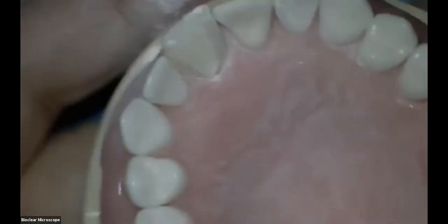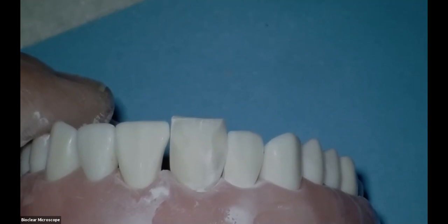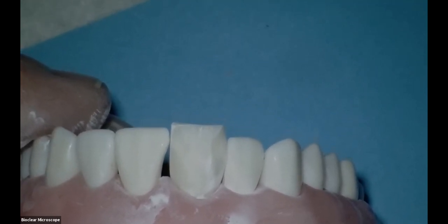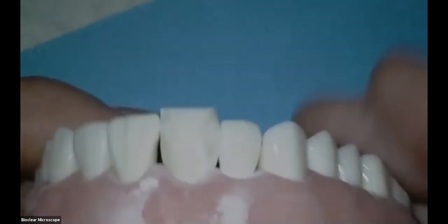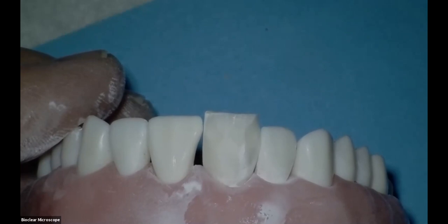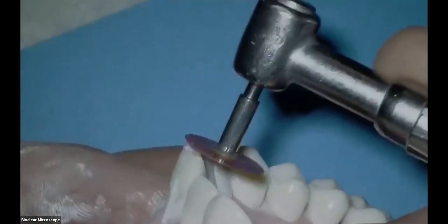Softflex XT disc. Now we're going to bring the Softflex XT disc. This is the 3M disc. I'm going to bring this to grade, and we start on the incisal edge, and we're going to tip that disc about 15 degrees to the palatal, because that's the typical wear pattern. Now, each case will be a little bit different, but these incisal edges are really important to the patient. And so I'm going to bring this in at about 15 degrees, like so.